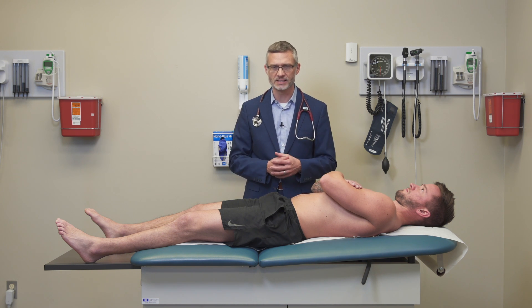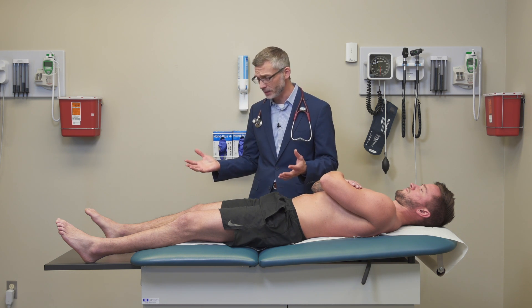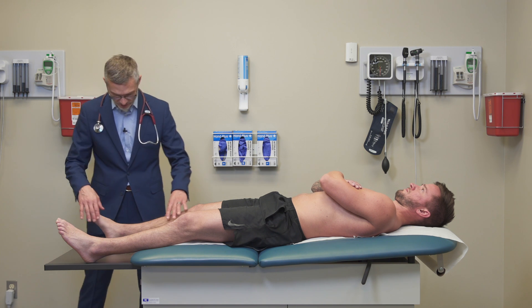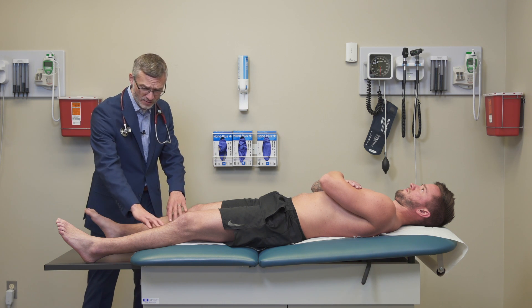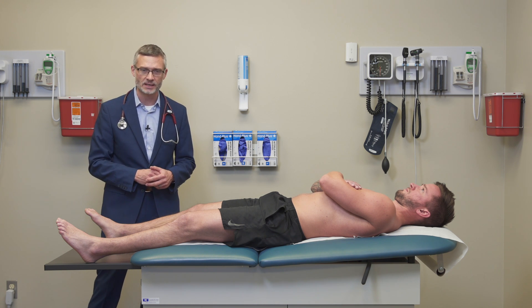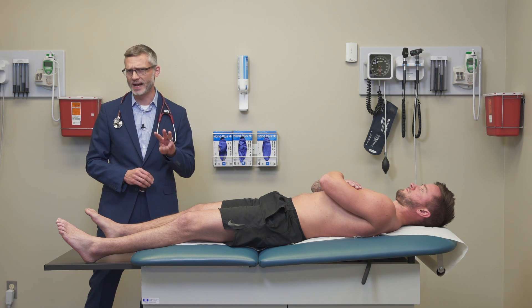There are a number of different findings that have variable levels of significance when making the diagnosis of peripheral arterial disease. Looking at our patient, the color of his legs looks good. He has hair on his toes. There's no evidence of any ulcers on the medial or lateral aspects of his feet, and there's evidence of good normal muscle bulk on both sides. So this is not a person where we're likely to find significant arterial disease. But there are three particular findings which can be really helpful to pick up potentially subclinical peripheral arterial disease.